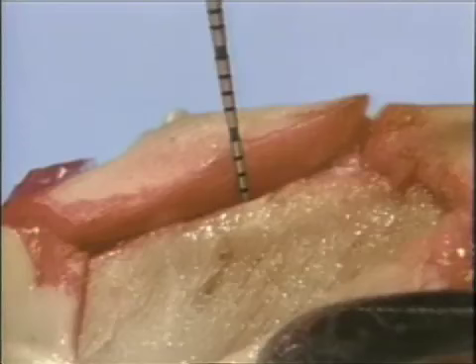We can now measure the thickness of the full thickness flap. In this case, measuring 3 to 4 millimeters and including oral epithelium, gingival connective tissue, and the underlying periosteum.